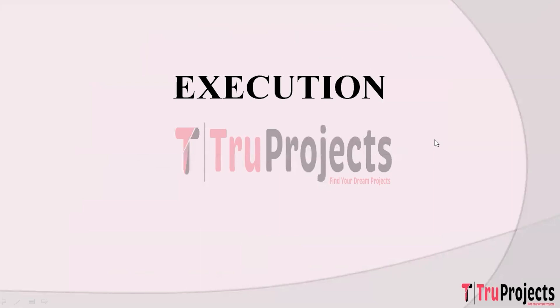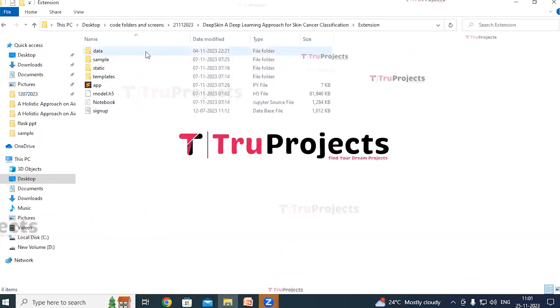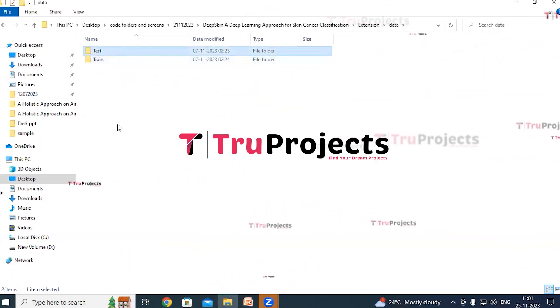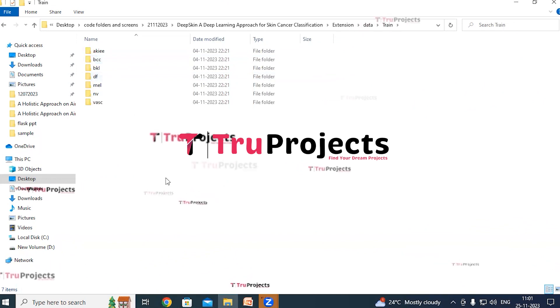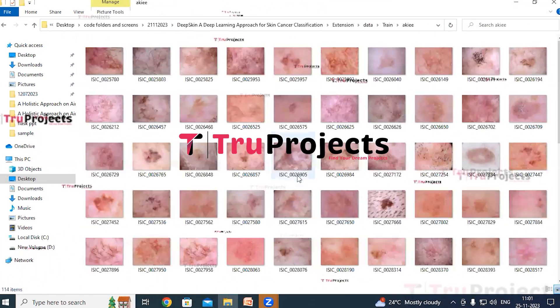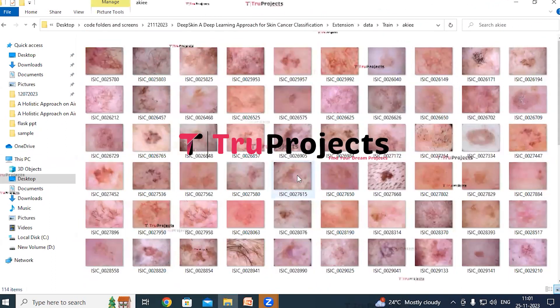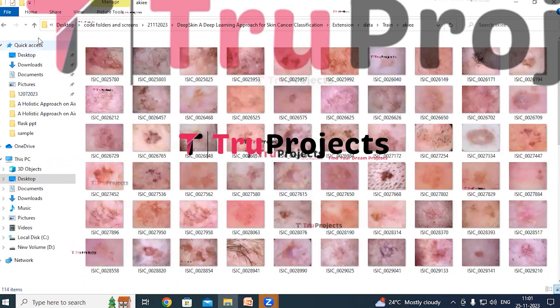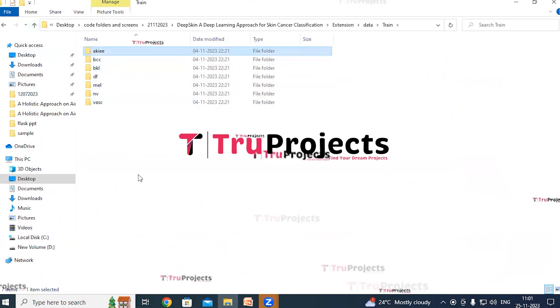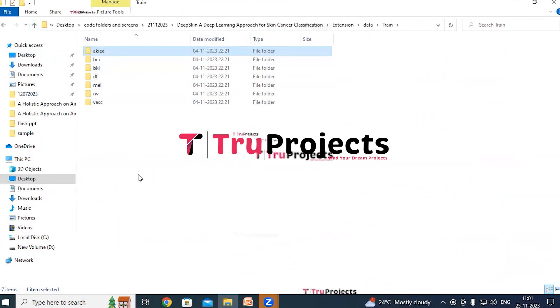To execute this project, first open the code folder containing the project source code files. The data folder contains trained and test subfolders. In the train folder there are seven different class image folders. These images will be used to train the deep learning models.